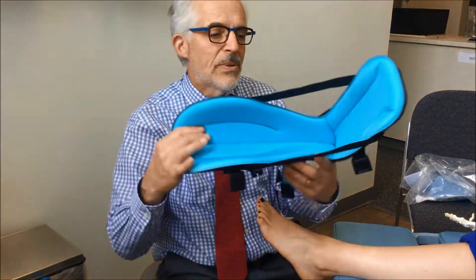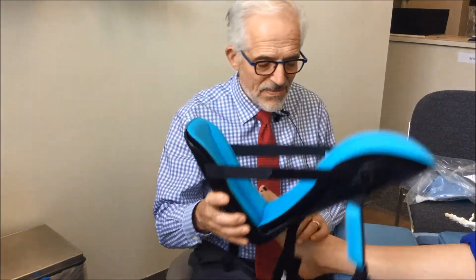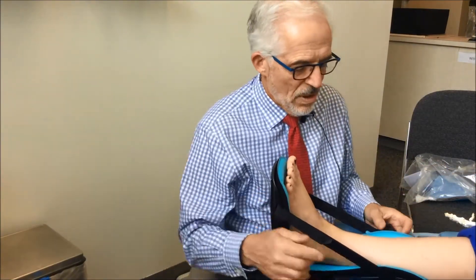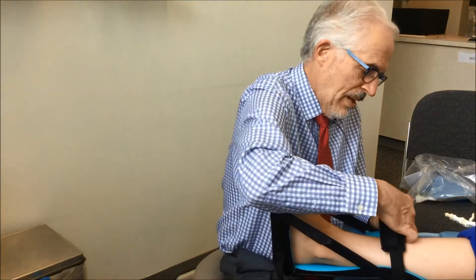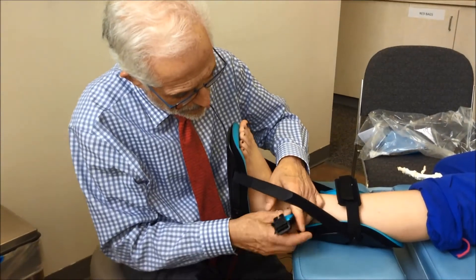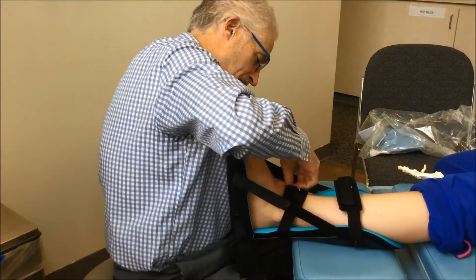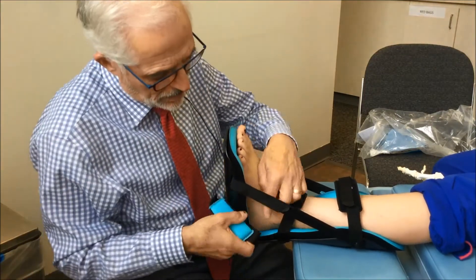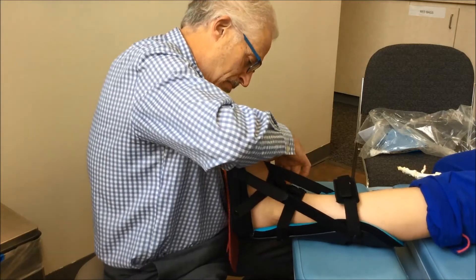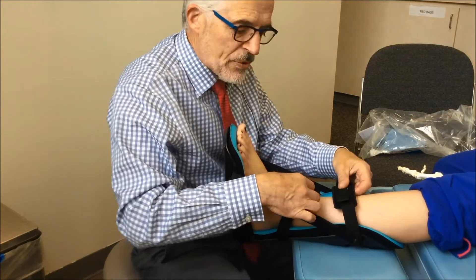What we've come up with is adapting a splint like this, that's placed on the foot, easily secured to the leg. It's comfortable to wear.